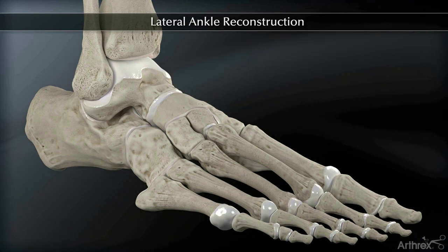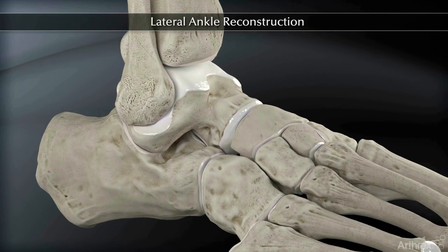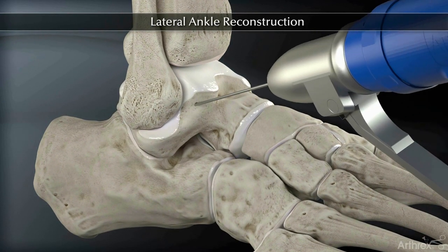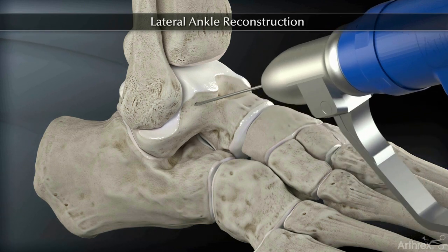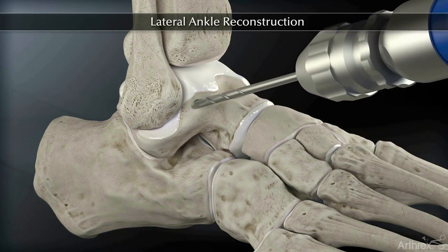Initially, a tunnel is drilled in the talus, making sure not to violate the articular cartilage. Insert a 2.4 mm tenodesis guide wire into the talus from dorsal to plantar. Drill over the guide wire with a 5.5 mm cannulated drill to a depth of 17 mm.